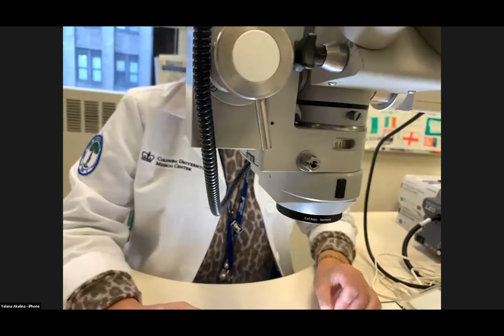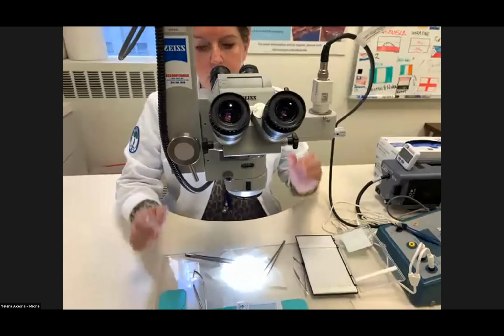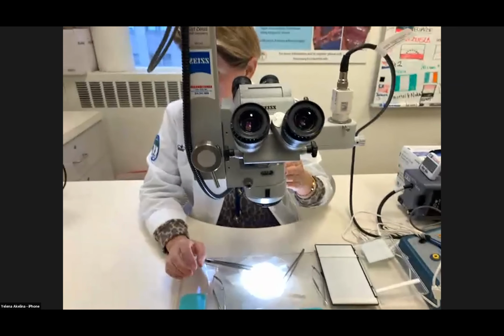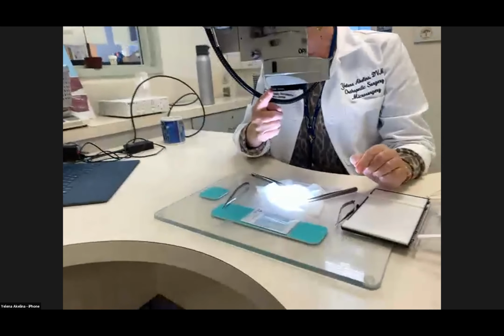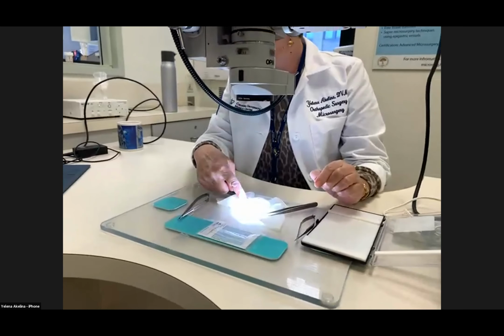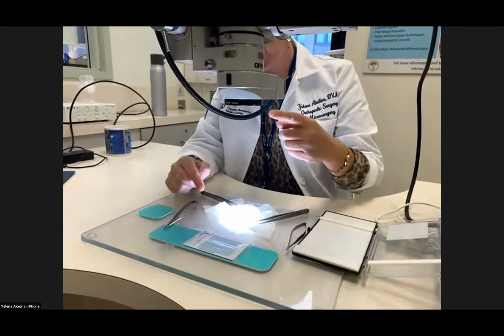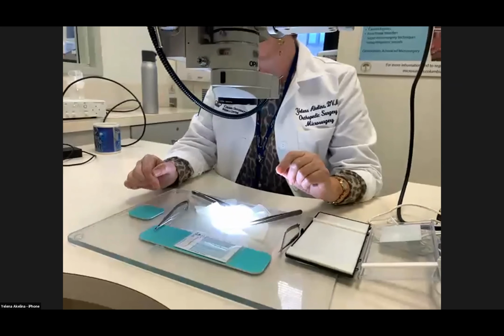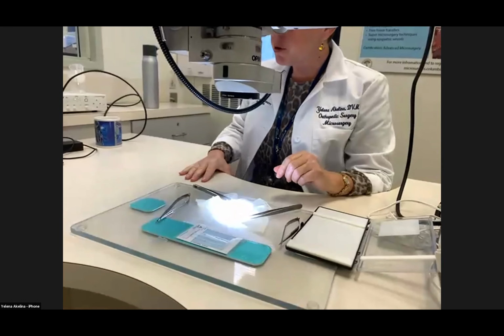Okay, people are asking how to adjust the microscope. So the microscope adjustment, let's go over really quickly. The microscope has a focal length, which is from the lens to the board, to the surface that you're working on. That's called focal length. So mine is 200. And I have a pedal underneath of the scope, which I can control with my foot.